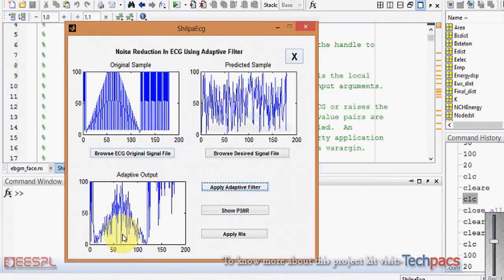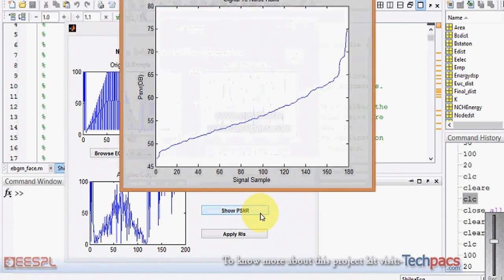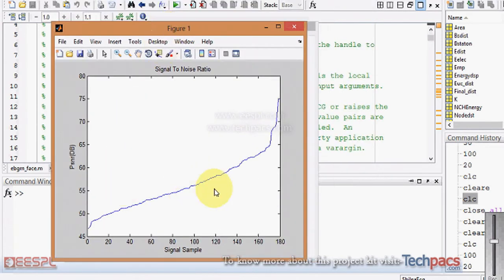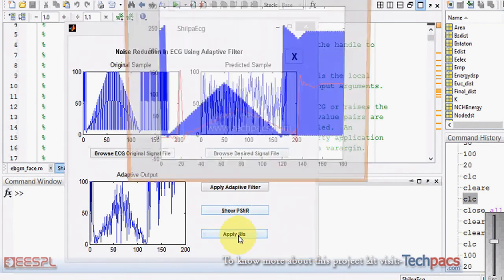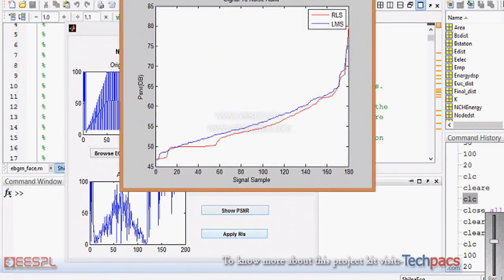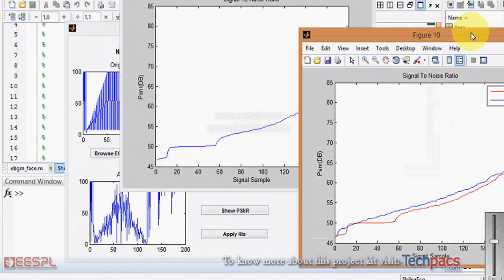We can also view that particular signal in the graphical user interface. To show the peak signal-to-noise ratio — it is increasing with respect to each sample, which means the noise is going to be decreased. When we apply the RLS algorithm, it generates this signal.